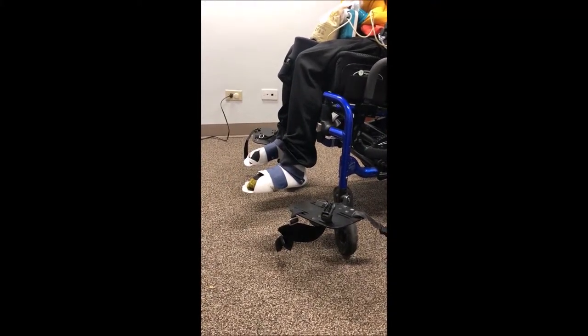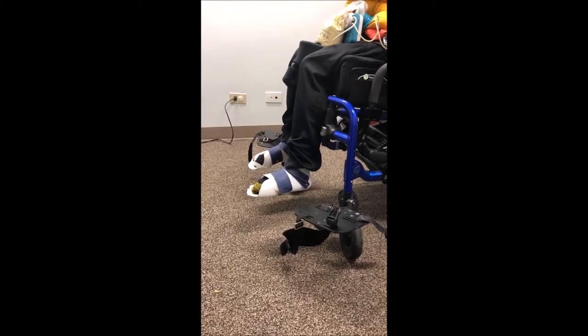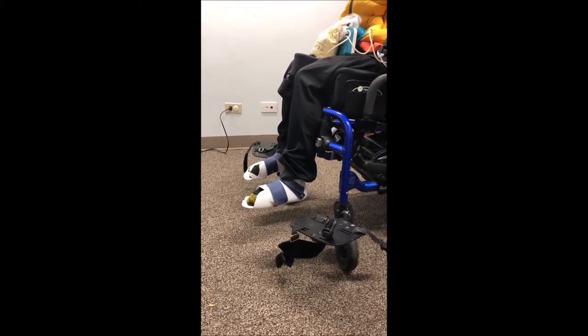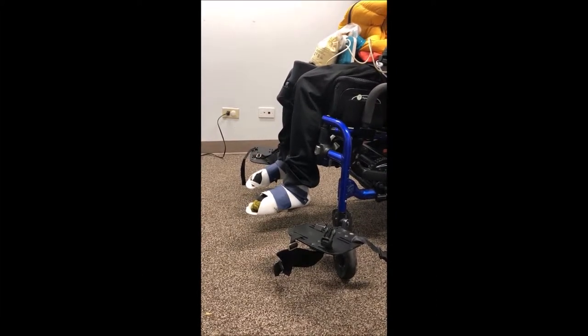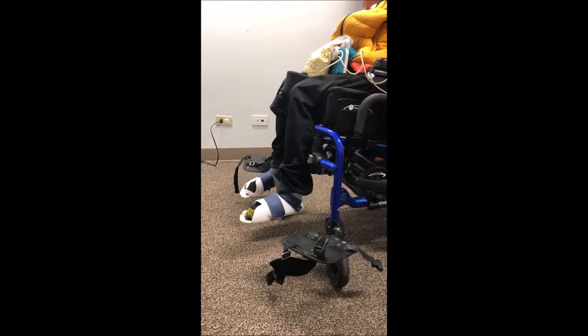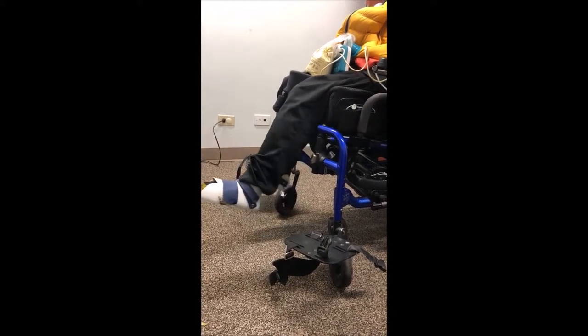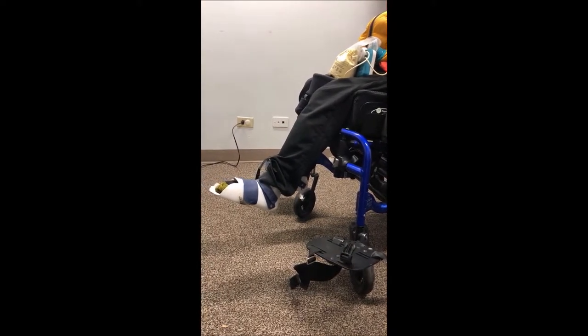This is Jonathan, a young adult with cerebral palsy. He has very significant extensor tone throughout his body. We wanted to simulate whether dynamic footrests would work well for Jonathan, but putting these dynamic footrests on his chair would require modifications to the chair that made simulation impractical.